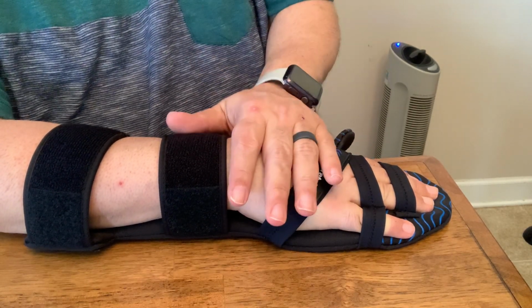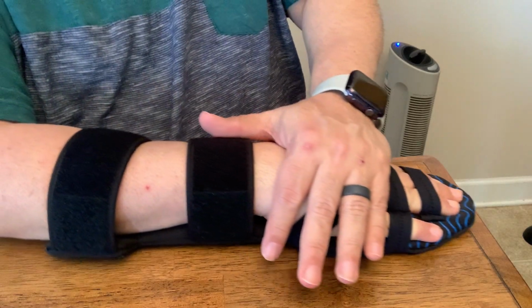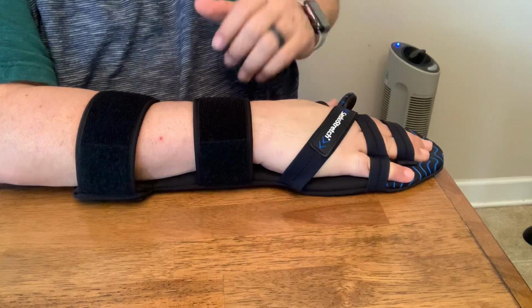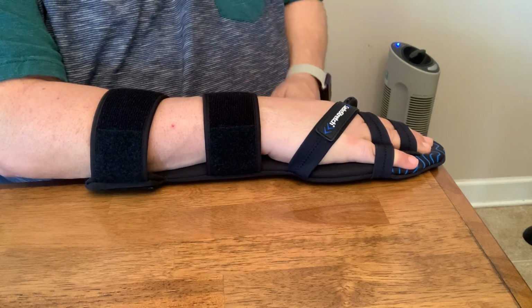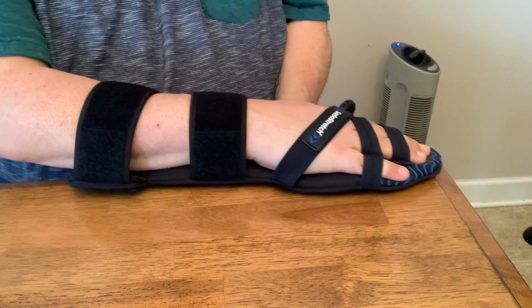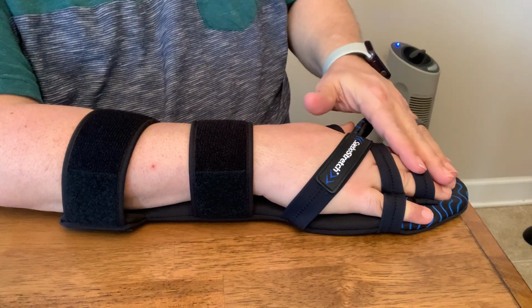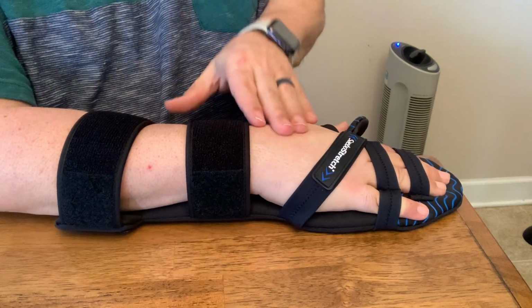It does take a little pressing down to flatten your hand, holding it. But I'm telling you, the key to securing everything is to go to the edge of the table. And this is the edge of the table. See my hand wobbling? Okay, so you pull it and tuck under. You tuck under, there's going to be some room under here. And you can Velcro too. So everything can be tightened on your own. That's how you put on a SaeboStretch by yourself.